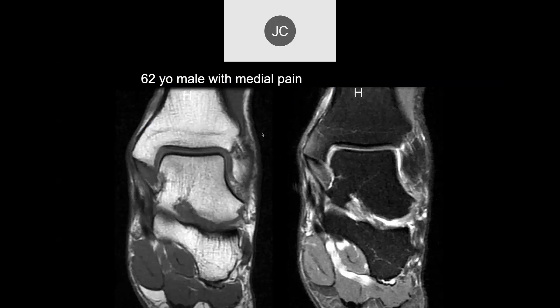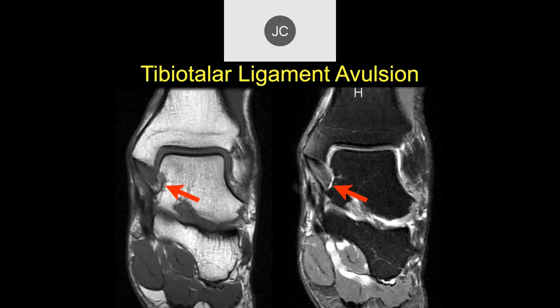Robert, what do you think of this 62-year-old male? It looks like there's a tear of the deep deltoid right there — diffuse increased signal intensity. We've lost that striated appearance to the deep deltoid. So that's a tibial-talar ligament avulsion, or deep deltoid ligament avulsion.